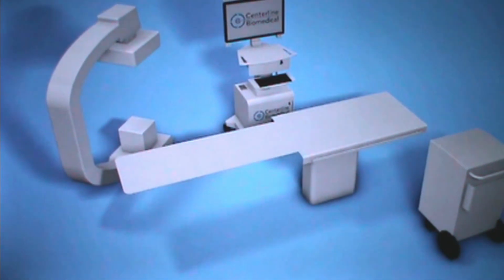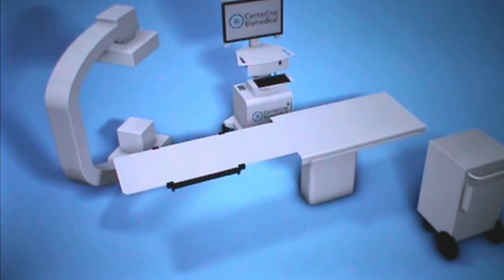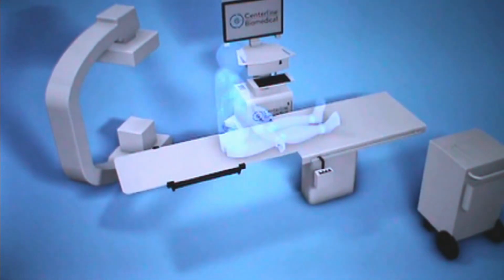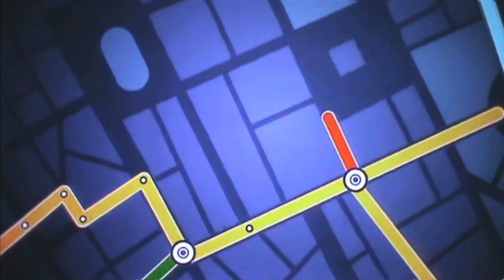So we're all familiar with GPS. It's this technology that lets us know exactly where we are anywhere in the world. So under the table in the operating room, we have this array of antennas, and these are like the satellites that are in orbit. So each of them is sending out signals. And then on our tools, like the catheters and guide wires that go inside the patient, we have little receiving antennas. So these are like the antennas in your car or in your cell phone.